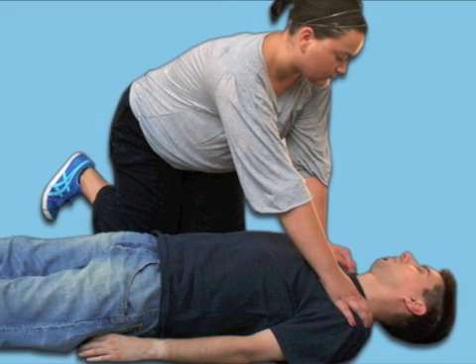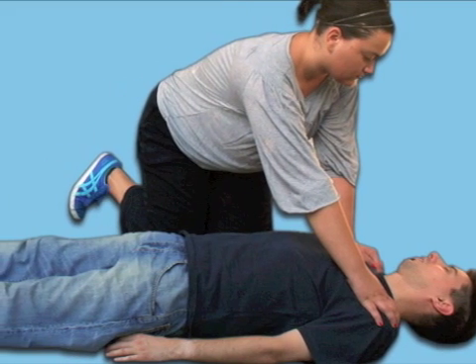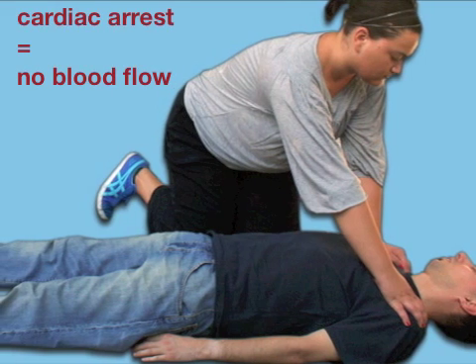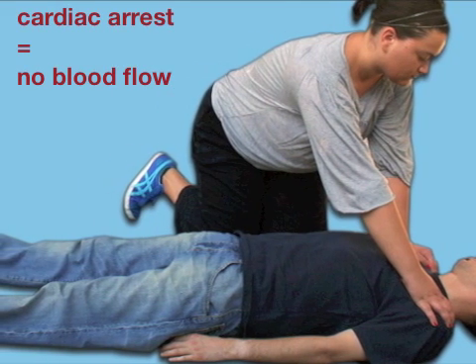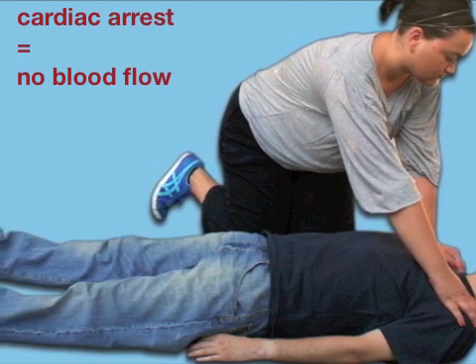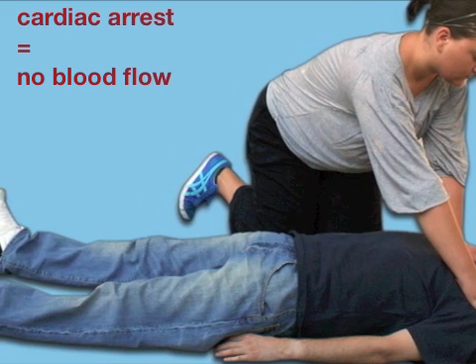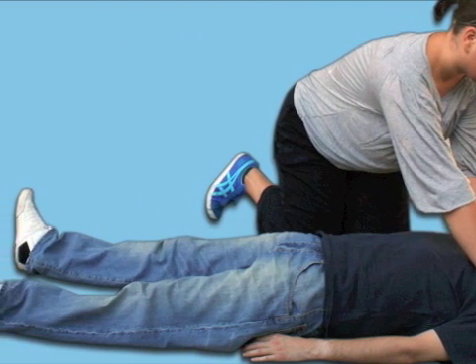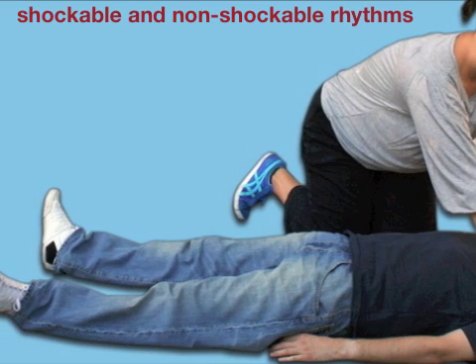In the case of cardiac arrest, the victim collapses because his heart no longer effectively pumps blood. However, there are several underlying heart rhythms which can lead to this state. They are so-called shockable and non-shockable rhythms.